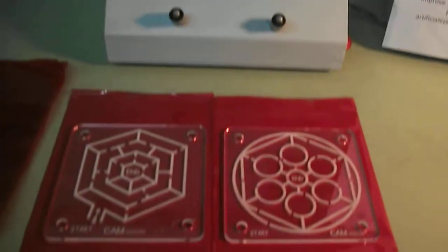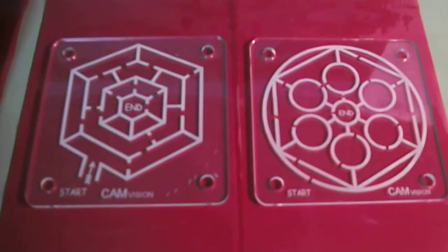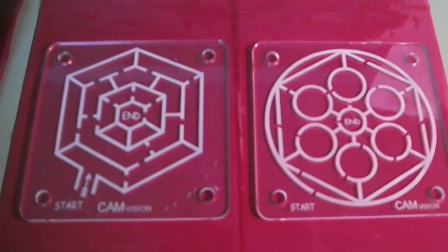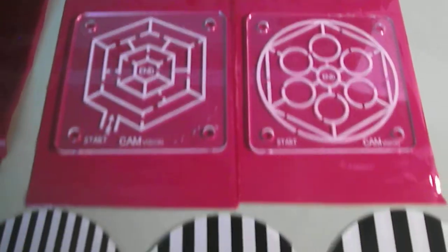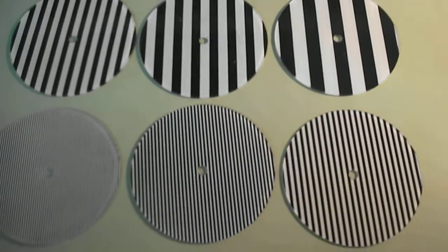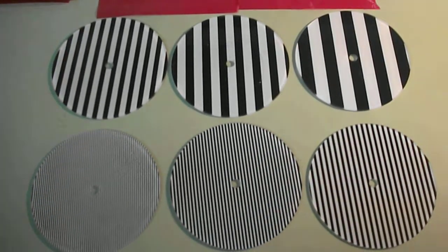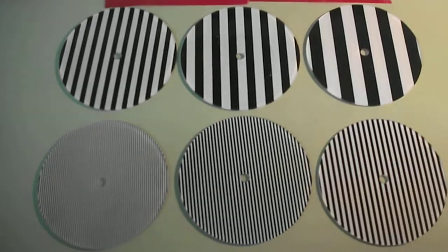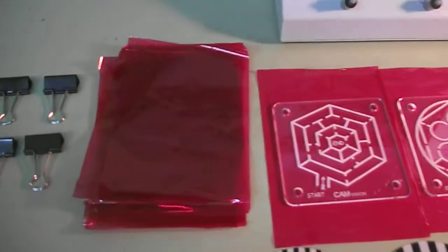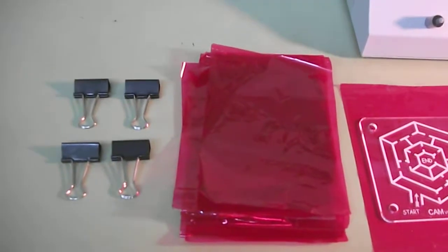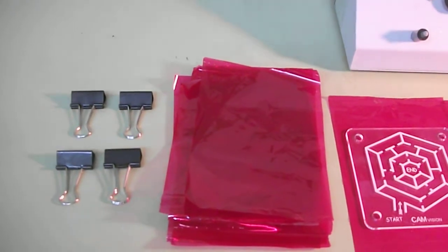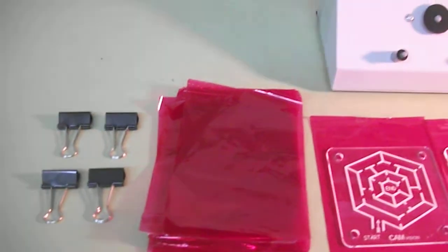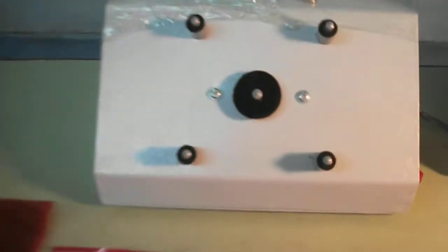So here you can see there are two types of grating plates. Apart from these two plates, we have six different types of discs which are rotated on this machine. We also need to have some cellophane papers and some clips to attach this paper to the clip. So here this is the machine.